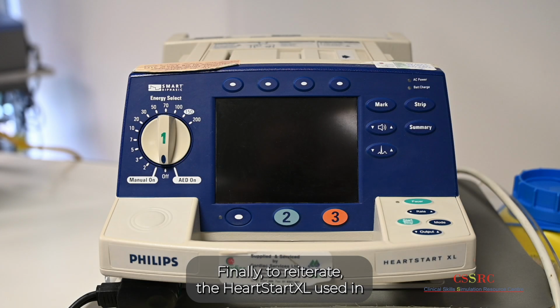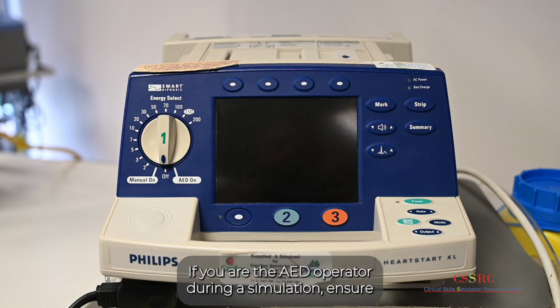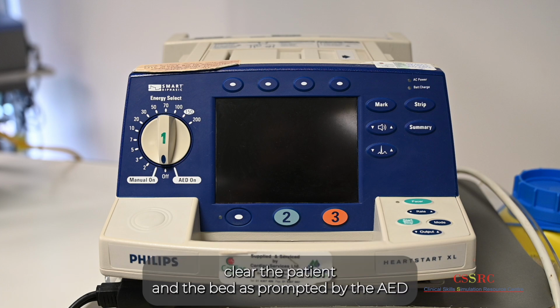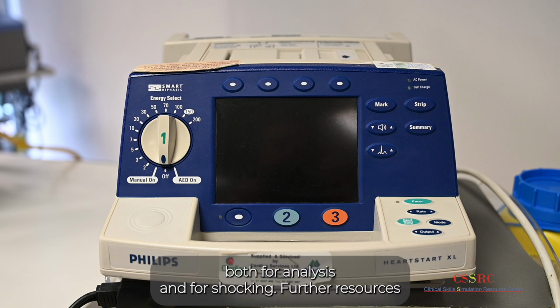Finally, to reiterate, the HeartStart XL used in the simulation suite is a real AED, delivering a live shock. If you are the AED operator during a simulation, ensure you verbally, visually and effectively clear the patient and the bed as prompted by the AED, both for analysis and for shocking.